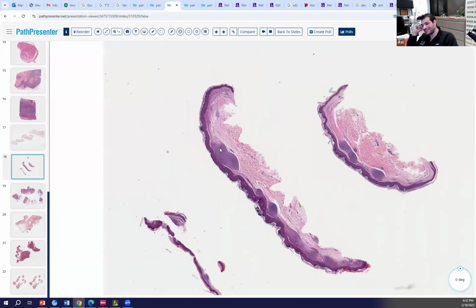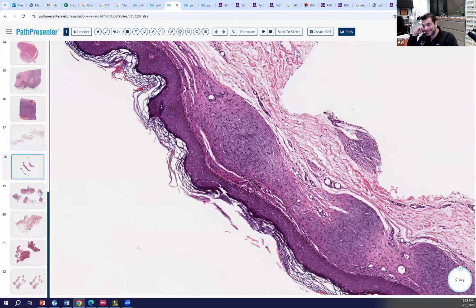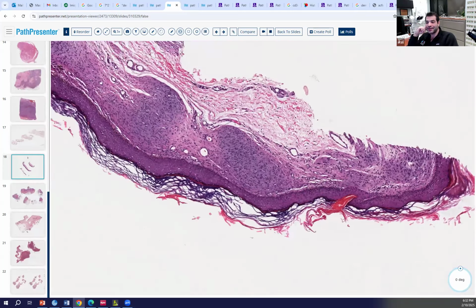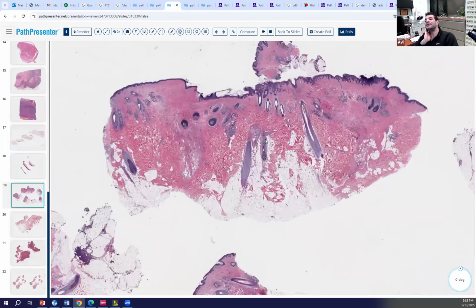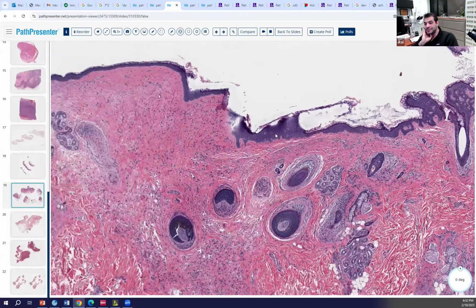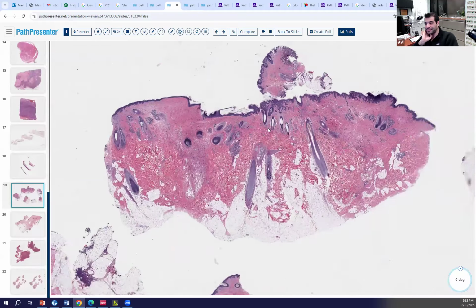We went over this. See, what is it, guys? You know this now? Whirling sclerotic stroma. Sclerosing perineurioma. Yeah, good. Sclerosing perineurioma. Where are we now? Scalp. Yep, we are on the scalp.